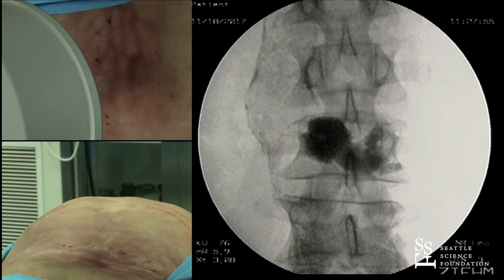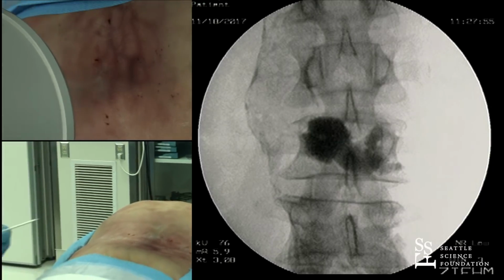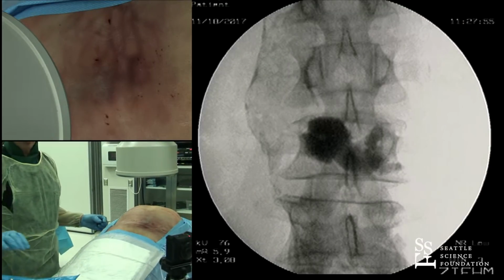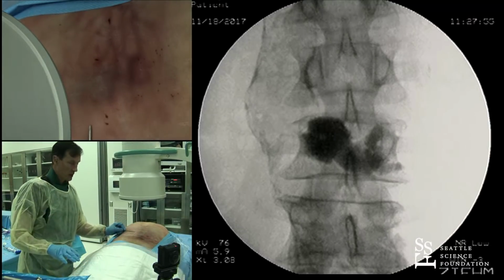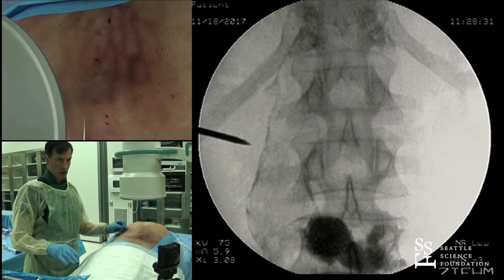Next thing I want to do is show you an implant. So we will do, let's see, let's do the level above that. Okay, cool. I will reuse the same. You've got really good fill on both the AP and lateral. I really like that end plate to end plate, and it's right in the center, and that is enough to support this without any specific additional difficulty that we have.